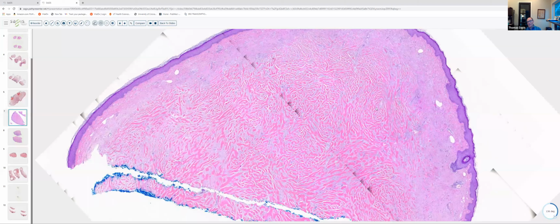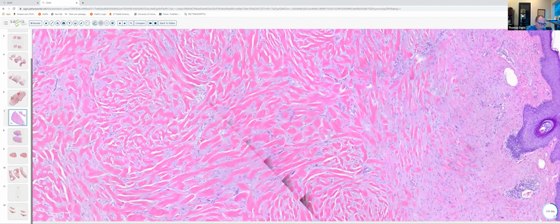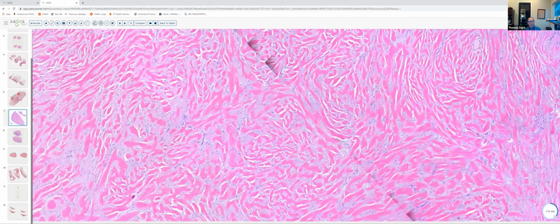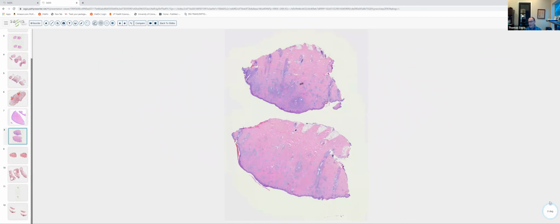If we take a hypertrophic scar with these nodules and whorls of fibroblasts and thickened collagen bundles and add these brightly thickened eosinophilic collagen bundles that are kind of broad and interconnected, this, of course, is keloidal collagen, and this is a keloid. And a keloid really is nothing more than a hypertrophic scar characterized by these broad eosinophilic, bubblegum-like collagen fibers. So hypertrophic scar, keloid. Important to understand that distinction. And then we'll close out our discussion of fibrotic disorders.